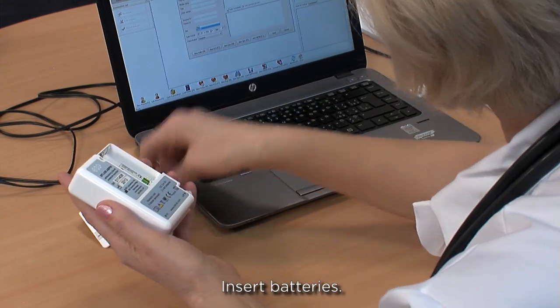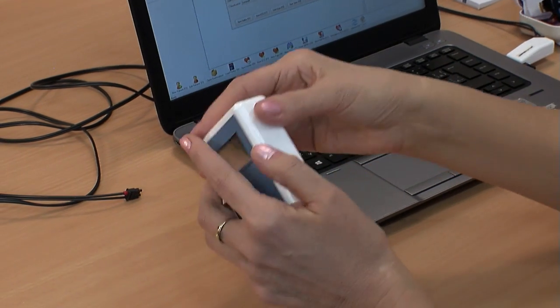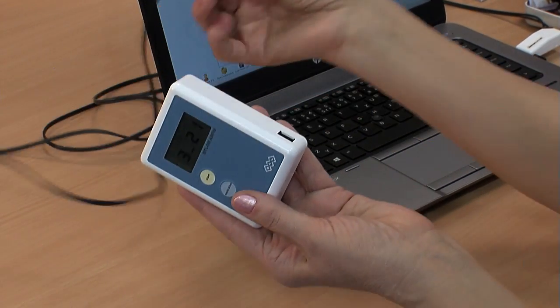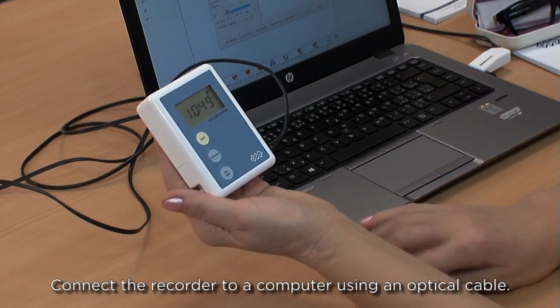Insert batteries into the recorder. Then connect the recorder to a computer using an optical cable and set the examination details.